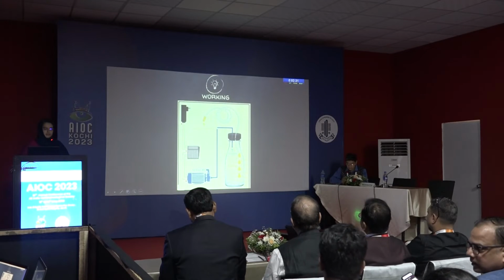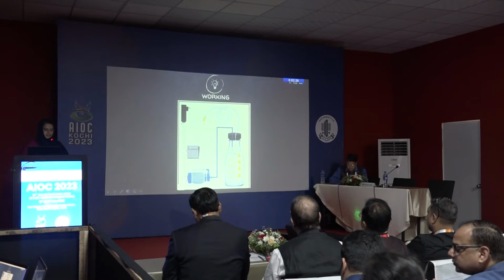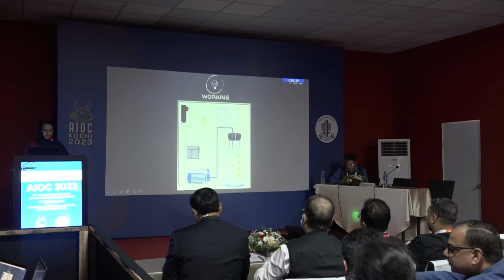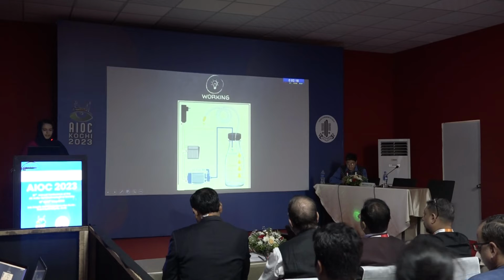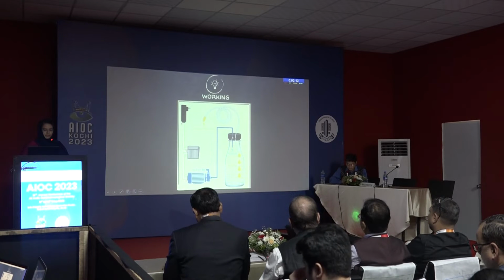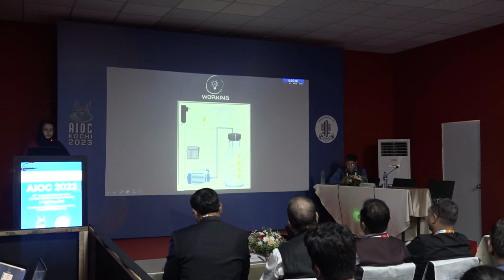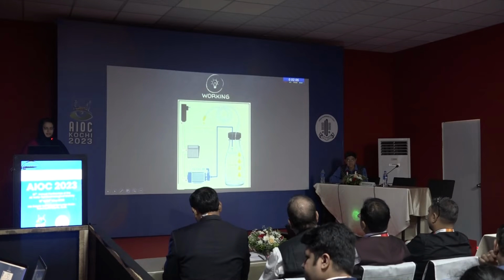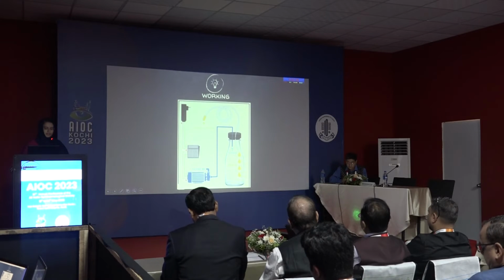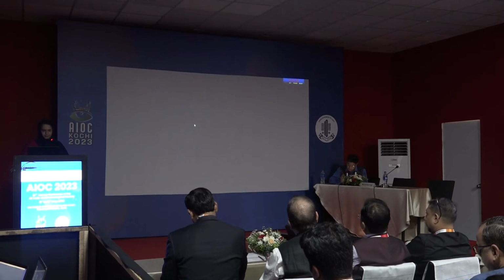And how does it work? It works by direct current which is connected by an adapter, and this adapter is connected to a foot pedal which acts as an on and off switch, and this foot pedal is connected to a self-priming motor, and the aspiration end of the motor is connected to a tube which is connected to an opening in the collection bottle, which will create a vacuum inside the collection bottle, and there is another opening in the collection bottle to which the intravenous set is connected, which will collect the aspirated fluid inside the collection bottle. The other end of the aspiration tube can be used in the surgical field.